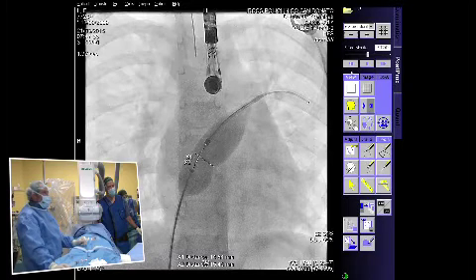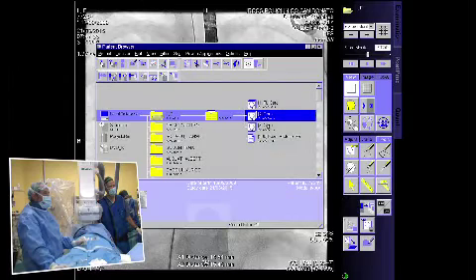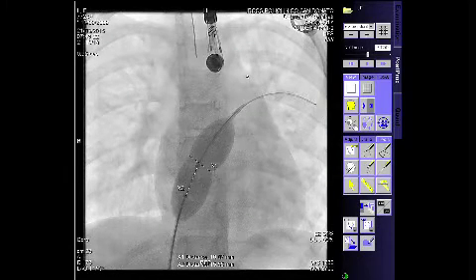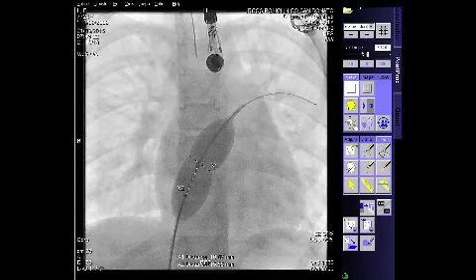Well, we measure just a so-called stop flow technique. However, we had a nice indentation on the balloon going from 15 to 16. Nice, very central, localized. Very central, and with this picture, Aki, can you show us the echo with the balloon?